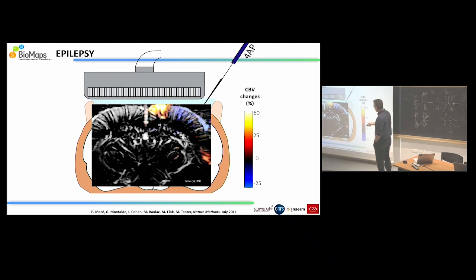So here you have the time that goes, and you see that the drugs has been injected here, so you see some movement of the red blood flow that goes to the thalamus. When it's blue, you have less blood that goes into the vessels. When it's yellow, you have an increase of the blood flow, and you see that it goes to the other part later. I don't remember. No, we don't see it. But you can follow some pathological things into the brain by this technique.